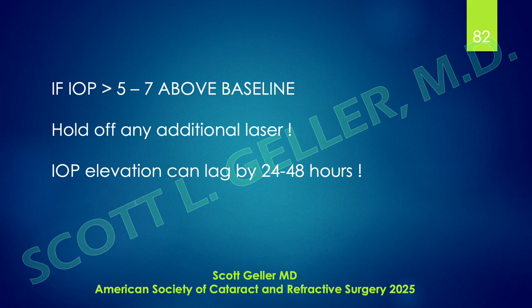If you have a patient come in and you're doing excessive laser and you know it's excessive, and you say, maybe we should put a drop in here, you might be masking the result. When the patient runs out of his drops, or you just say, use this for a few days, if you masked an elevation of pressure, that pressure will return to its elevated level, and you can get into some real problems. And they're not your problems, they're the patient's problems. So you need to be thinking about that all the time.